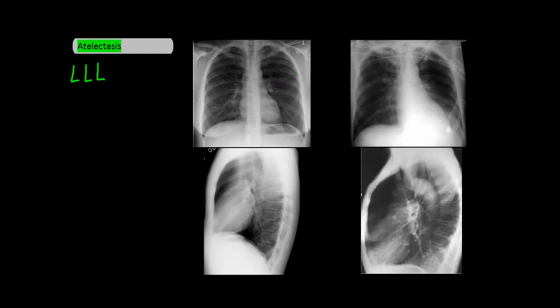Lastly, we have the left lower lobe. On the PA, the normal left lower lobe is here. Left lower lobe atelectasis looks like right lower lobe atelectasis, but just on the left side — the left lower lobe collapses downwards. Like right lower lobe atelectasis, the left heart border should remain visible because the left heart is not in contact with the left lower lobe. You'll also see the left diaphragm showing the silhouette sign. On the lateral, the oblique border shifts down and out, which is pretty much the same as right lower lobe atelectasis.